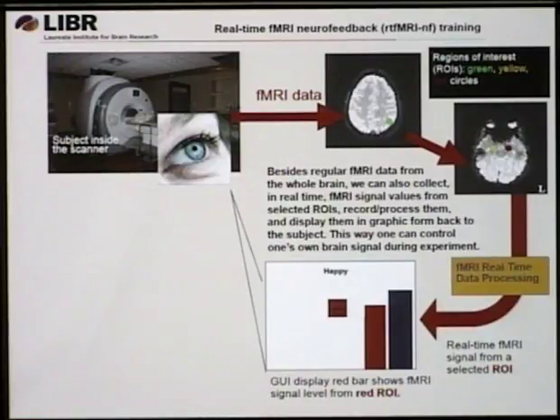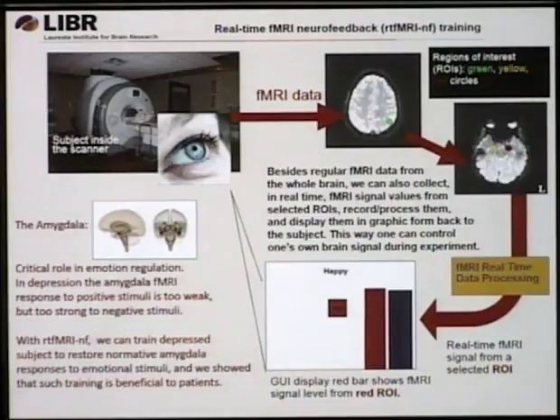And some people ask, why bother, right? There's a technique called biofeedback, which was used before MR, where you can, for example, use your heartbeat sound as a source of feedback, converting it to sound pitch, or use other physiological signals, and then try to control it yourself. But with the brain, the big advantage, especially with fMRI, is that we know where we are, so we can pre-select certain brain regions which, for example, may not work well if you develop, say, depression.